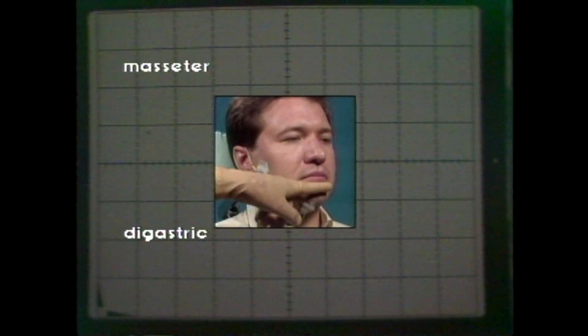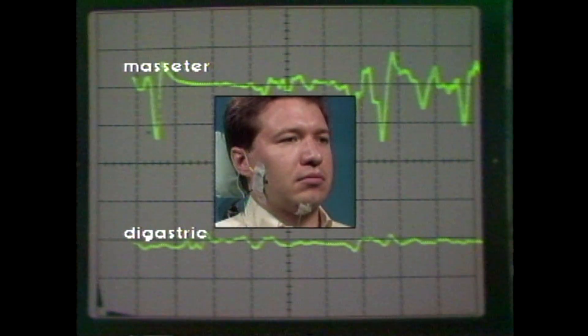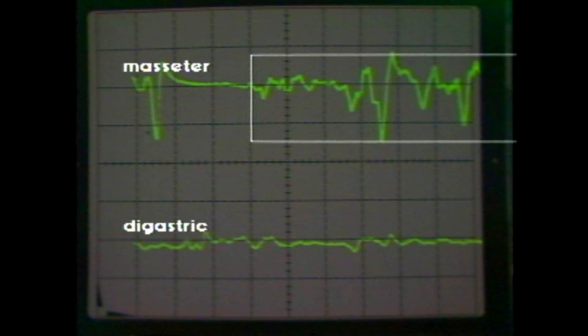The subject is instructed to unilaterally place a cotton roll between the posterior teeth, opposite the recording electrodes, and bite firmly. The oscilloscope is triggered and synchronous electrical activity is seen in the masseter muscle. Minimal electrical activity is noted in the digastric muscle. Motor units are recruited as seen by the synchronous wave, followed by a silent period of motor neuron and motor unit inhibition for 18 milliseconds. The time base is a 10 millisecond division. After the silent period, asynchronous activity is recorded.